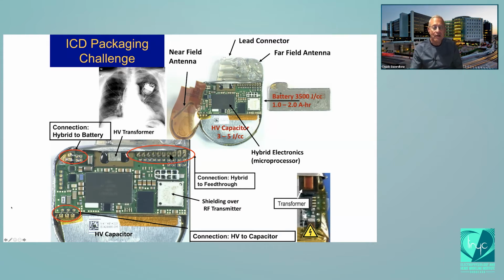But inside, the device is electrically isolated from the rest of the world, so that the only signals that get in, ideally, are the ones coming through the leads, and these should only be carrying cardiac information. And a lot of work is done, you'll see, to keep the electrical components electrically isolated.